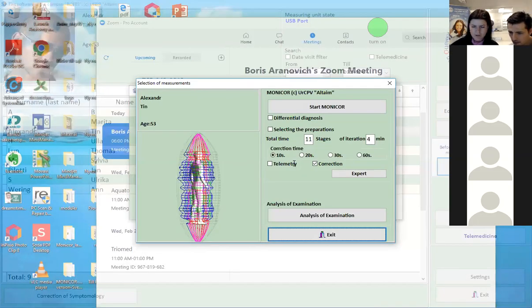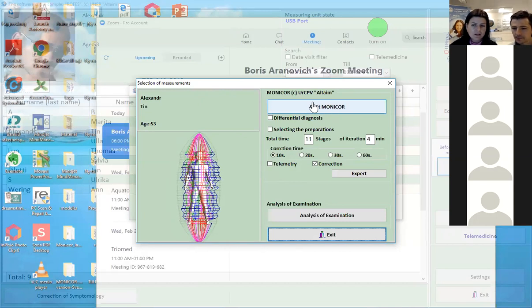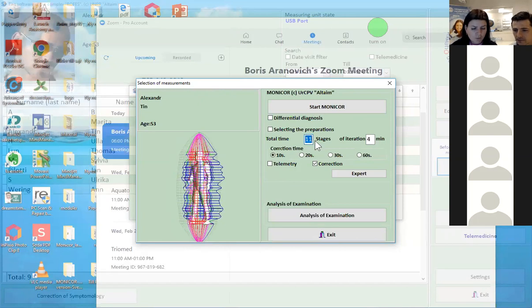Internet connection unstable. Here you will come to this first page, yeah? And here is the button Start Monicor. So basically, here you choose how many minutes you're going to work with the client. So I recommend starting from 15, 20 minutes. It depends on how good the results were on the patient.